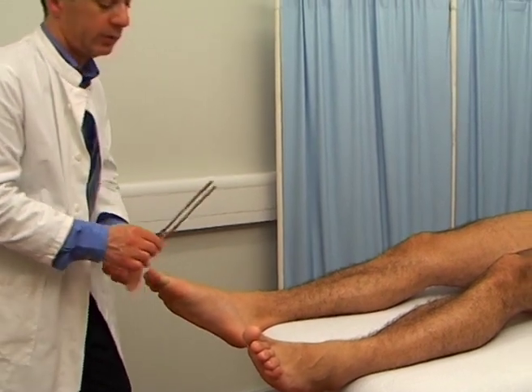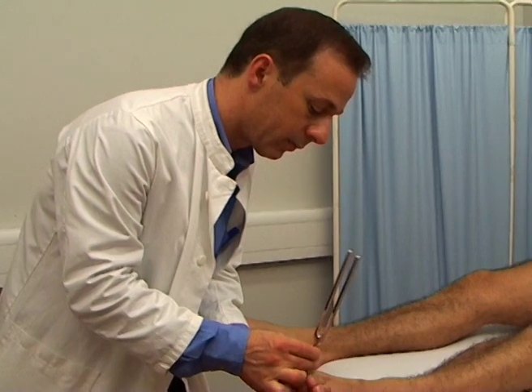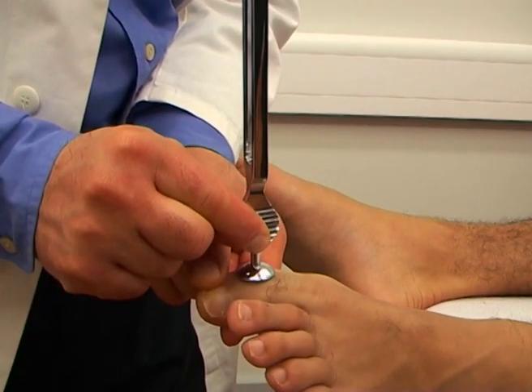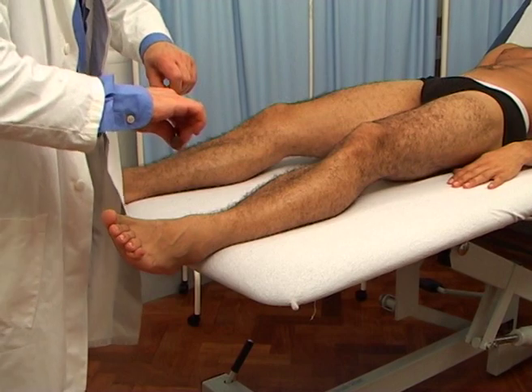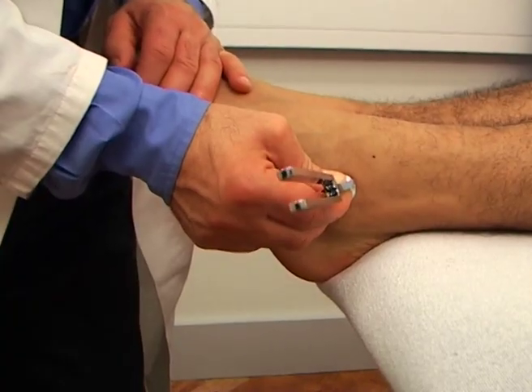Ask the patient to shut their eyes and press the base of the tuning fork firmly on a bony prominence. Start from the bony part of the big toe. If they can feel the vibration properly over both sides, then there is no need to test more proximally.